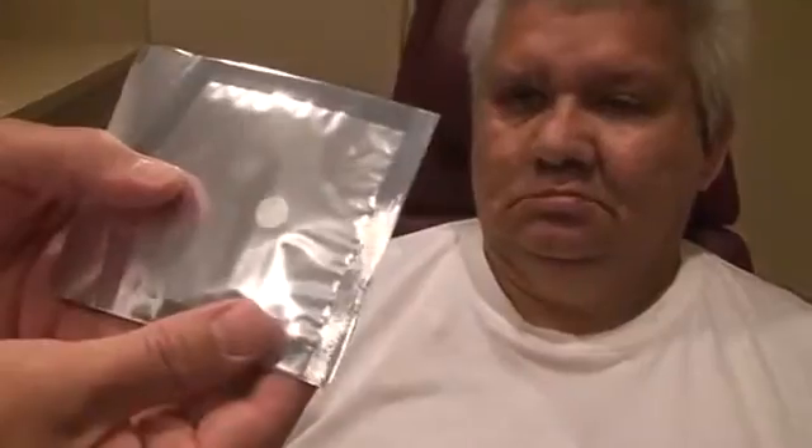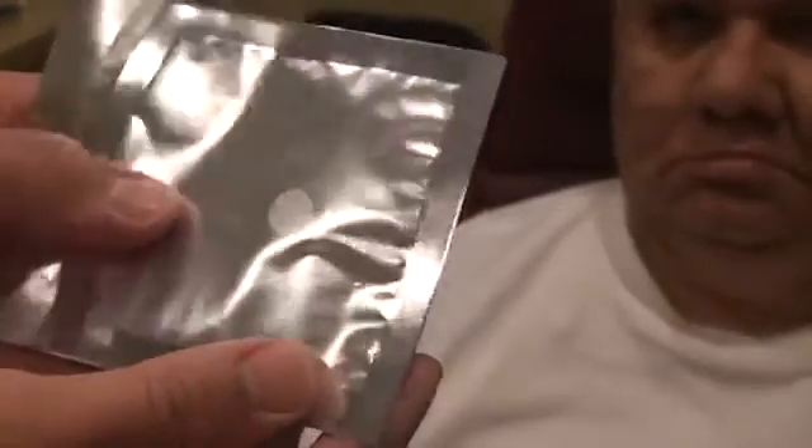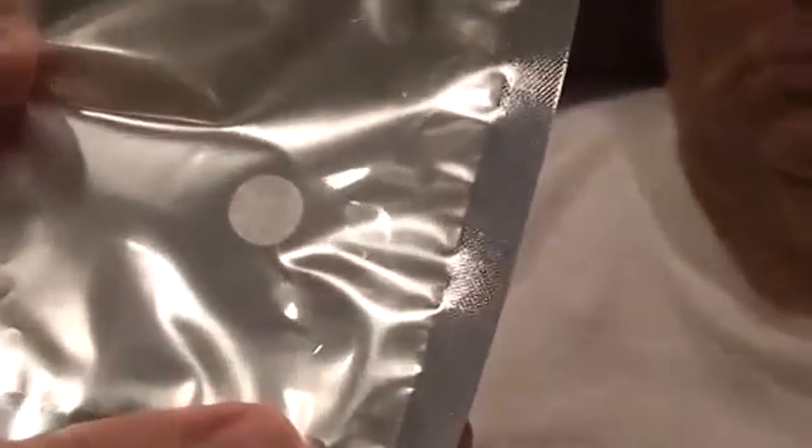You can dab away the excess. I don't know if it's going to be reflective or not — yeah, I'm getting a reflection on it. There we go. Can you see the O and the P? So that's just the designation.